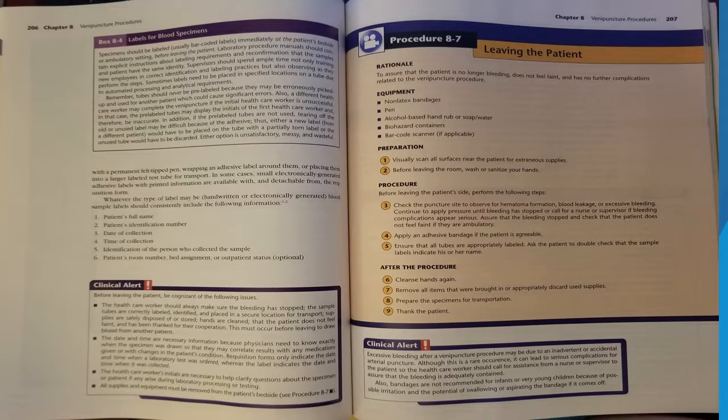Supervisors should spend ample time not only training new employees in correct identification and labeling practices, but also observing as they perform the steps. Sometimes labels need to be placed in specific locations on a tube due to automated processing and analytical requirements. Remember, tubes should never be pre-labeled because they may be erroneously picked up and used for another patient, which could cause significant errors.